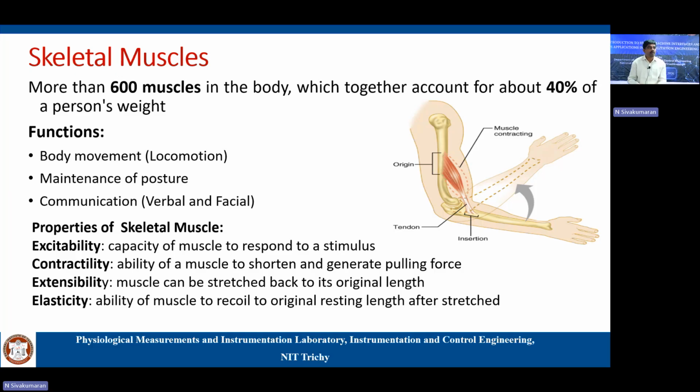If they are not doing well, this information could be given to trainers to design a person-specific protocol to improve their sporting performance. So EMG can also be used here. EMG along with inertial sensors and force sensors can be used to measure performance in professional athletes.